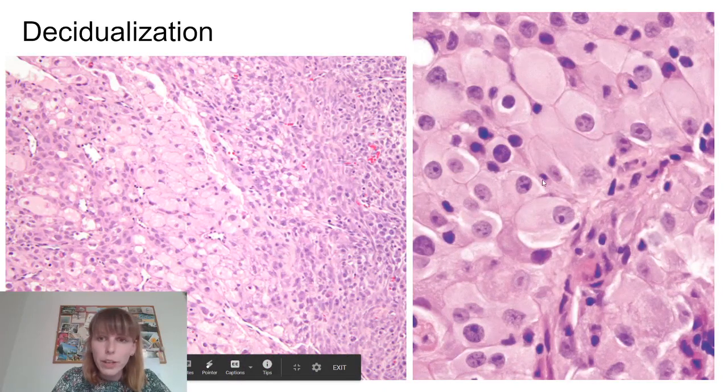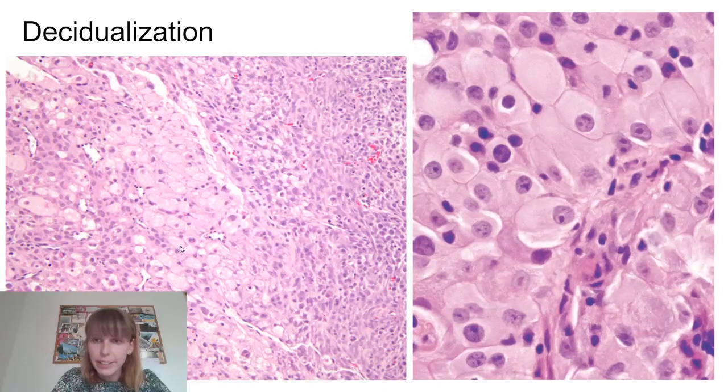So here you have a magnification of an area like this. This is still the stroma of the endometrium, and here you start seeing these huge cells. They are not round but polyhedral. You see some sort of angles, so that's just to say that the term is right. It's not nonsense. And these are the nuclei stained with hematoxylin because they are acidic, and the cytoplasm is very eosinophilic, very light, and it's light because of the lipids it's storing.